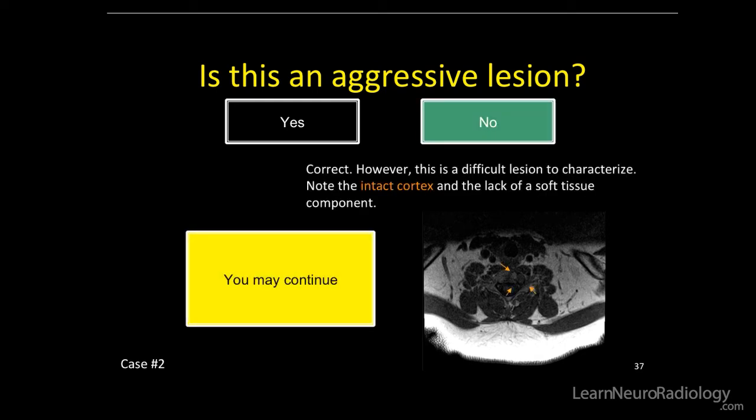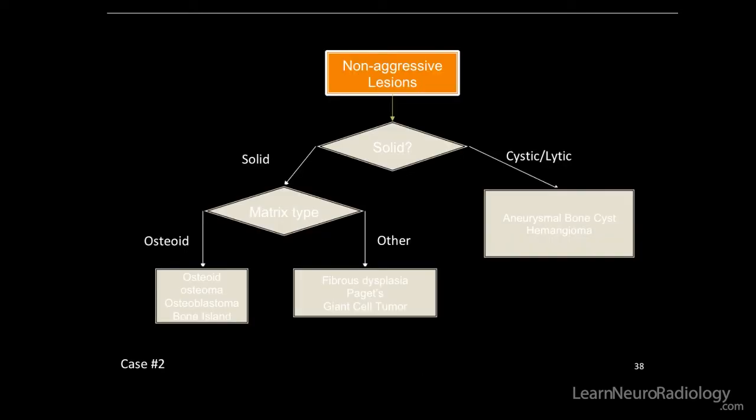Probably not. It's a difficult lesion to characterize, but there is an intact cortex on this T2 image, and there is no soft tissue component. So we're going to use the non-aggressive lesion algorithm for this case.